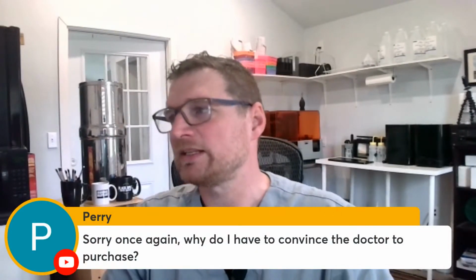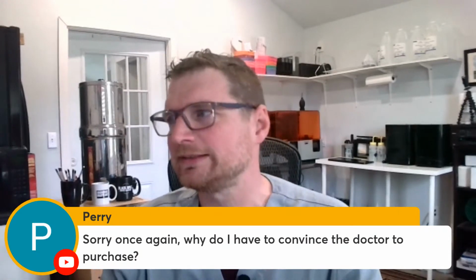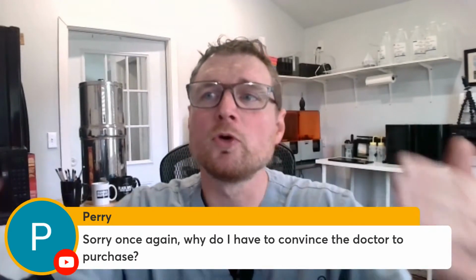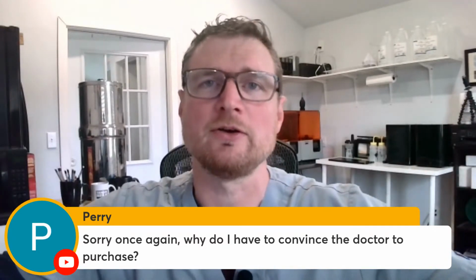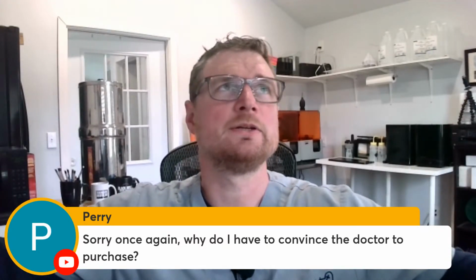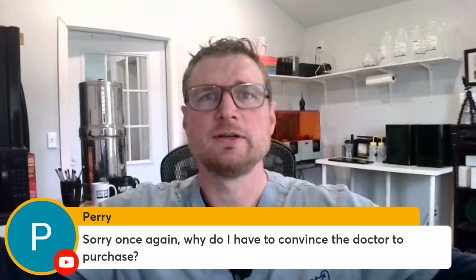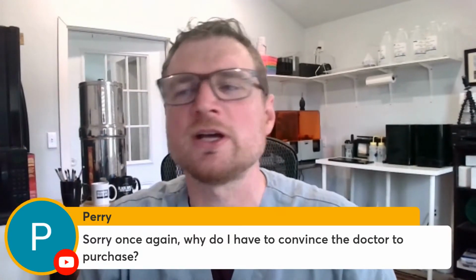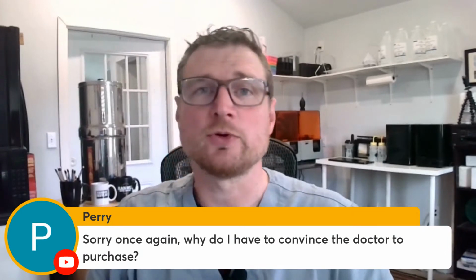Okay. Oh, this just finished. So yeah, Perry, it's an extra charge, and it's a hard sell for the doctors. But more and more, especially the ones coming out of residency offices or dental schools, are more inclined toward this more modern stuff, and so they don't mind paying for it, especially when it integrates with the software that they're using in-house.